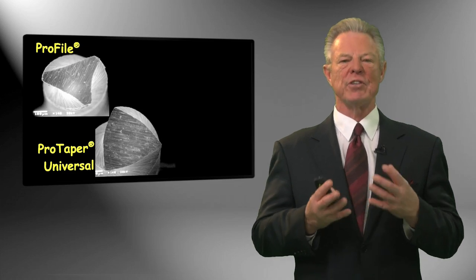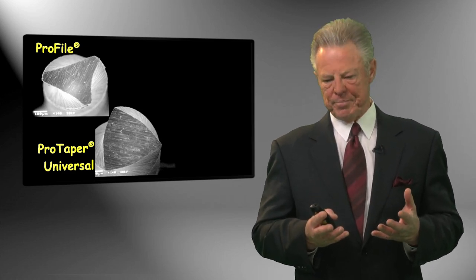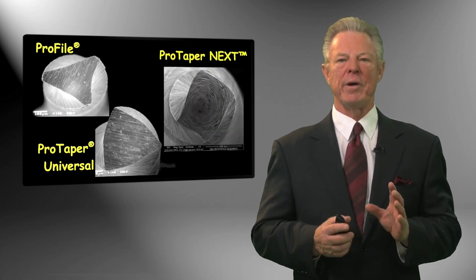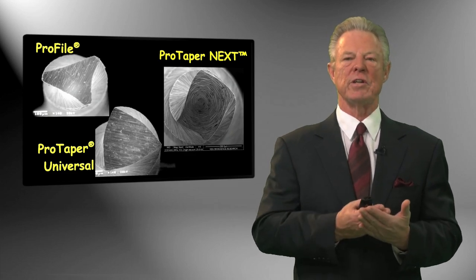And I think if you just talk to most endodontists, it would be unanimous that what they loved was that they cut. And then now with the ProTaper Next, you can see again, as we showed before, that horizontal cross section, which is actually a rectangle. In cross section, ProTaper Universal is a convex triangle, and notice there's 3 points of contact. The center of the file is in the center and stays in the center.